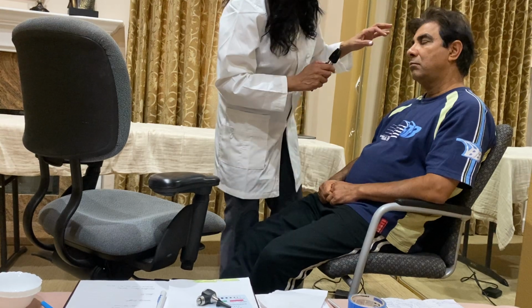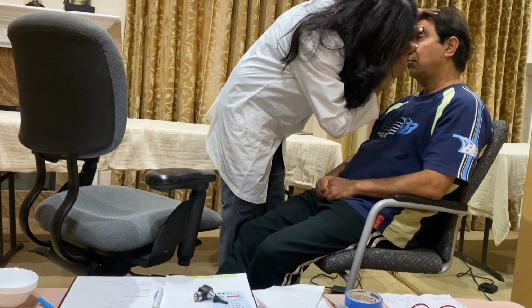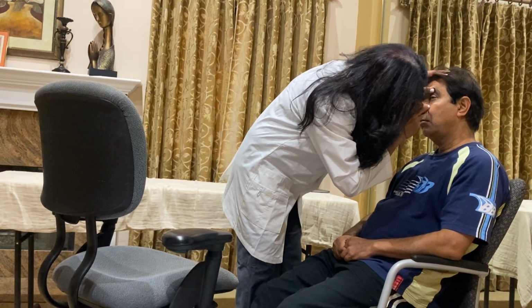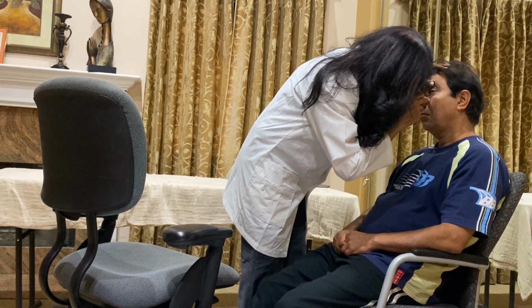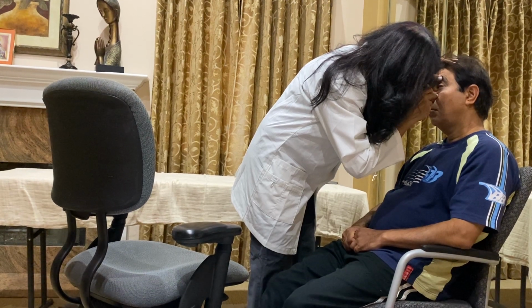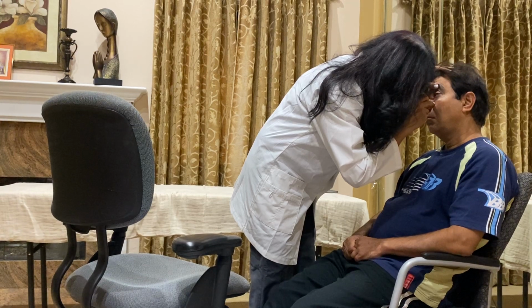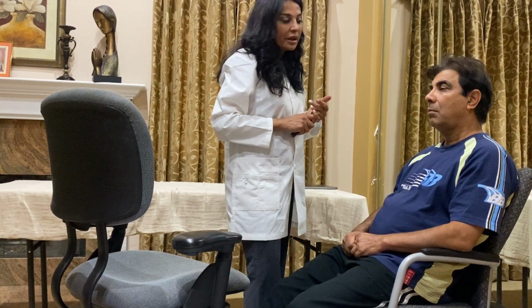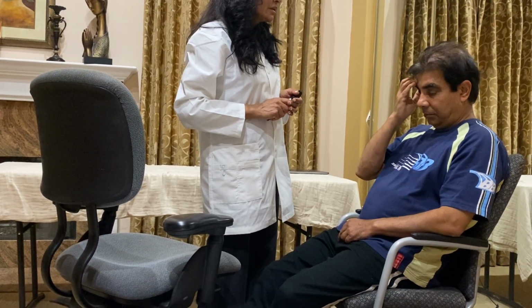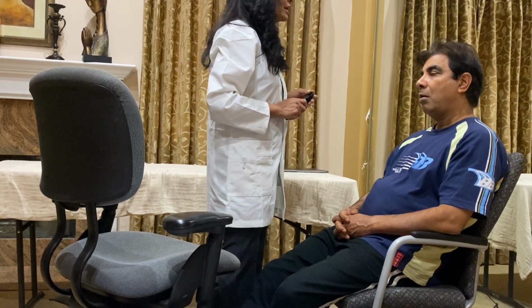Similarly, I'm going to examine his left eye also, and I'm going to see the same things. I'm going in, I'm examining, I see the red eye reflex, and then I'm going in, and I'm seeing that he has the blood vessels, and I'm following the blood vessels, and I see the cup and the retina, and it all seems normal. This concludes my ophthalmoscopic eye exam for him.